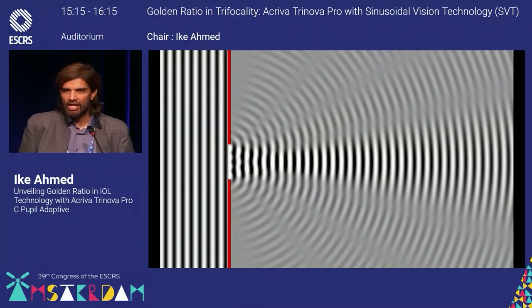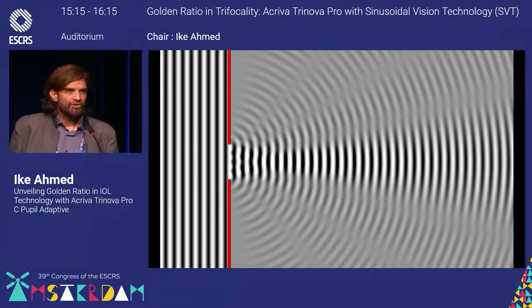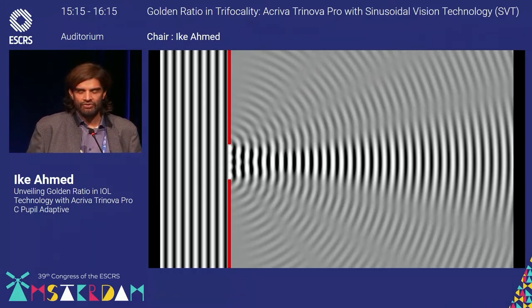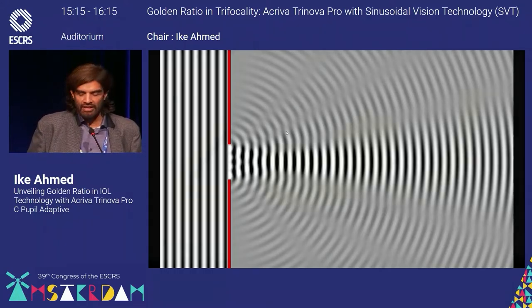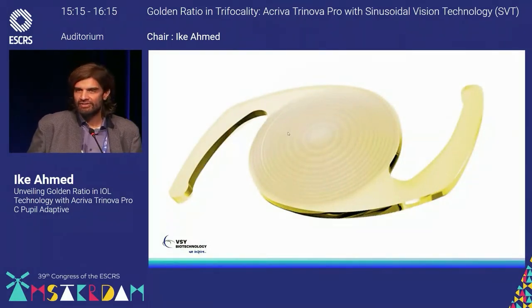Well, in ophthalmology and optics, we always talk about waves, right? Talk about wave and particle theory of light. Well, of course, in multifocal technologies and other technologies, we use diffractive gratings and obstacles to bend waves, to bend light. And the concept is waves. And you see, of course, diffractive gratings on different lenses.